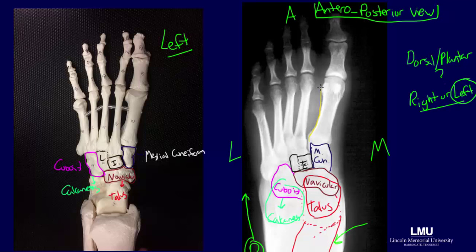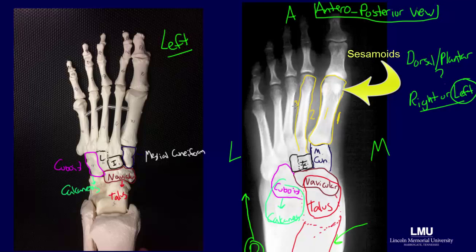The metatarsals, outlined here in yellow, articulate with the tarsal bones posteriorly and the phalanges anteriorly. Notice how the sesamoid bones are aligned under the head of the first metatarsal, within the tendon of the flexor hallucis brevis. Each of the metatarsals is numbered 1 to 5. The phalanges are the most distal bones of the foot, outlined here in orange. Notice that the first digit only has a proximal and distal phalanx, while each of the other digits has a proximal, distal, and intermediate phalanx.